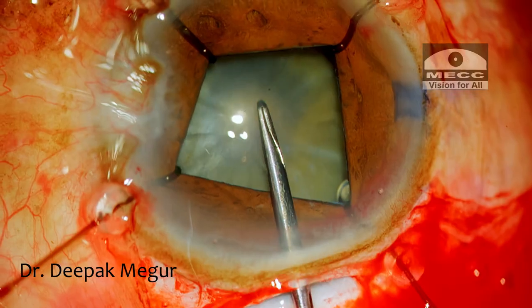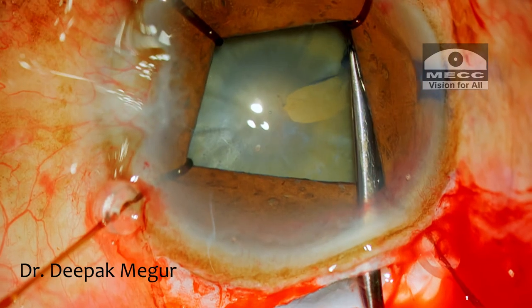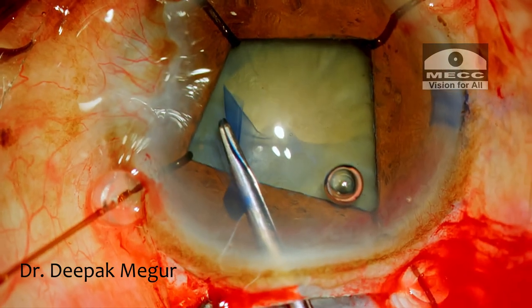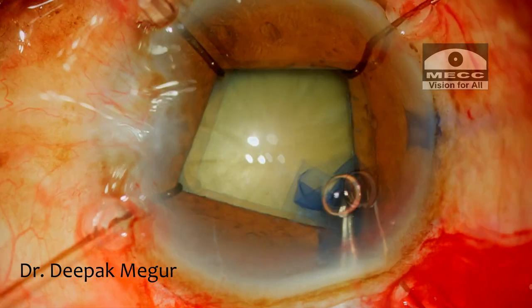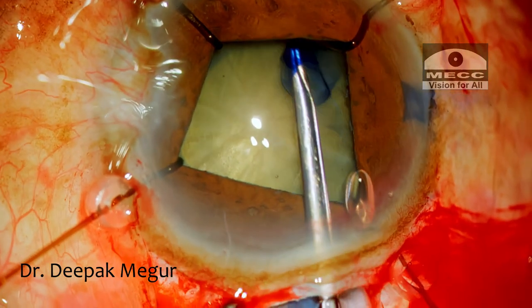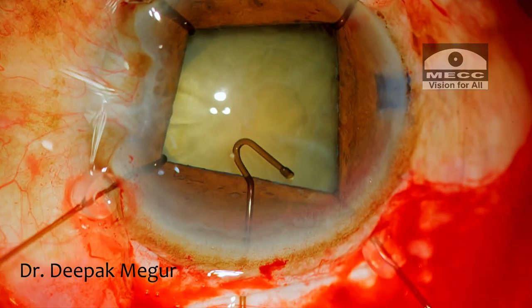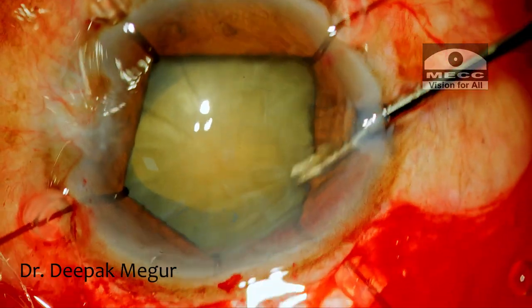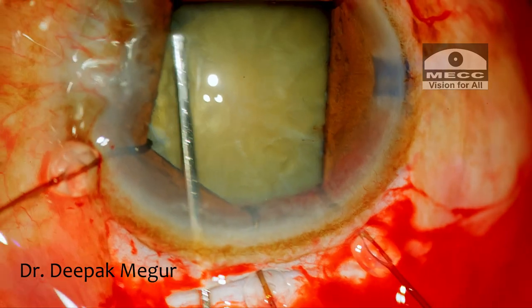As I'm puncturing the capsule, the compromised zonular apparatus is quite evident. The bag is wobbly — saving the bag is a challenge. The rhexis is created but turns out to be smaller than intended owing to the loose zonules. I introduce another hook through the main incision so I can see better and control what I'm cutting and tearing. Now I have a decent-sized rhexis.